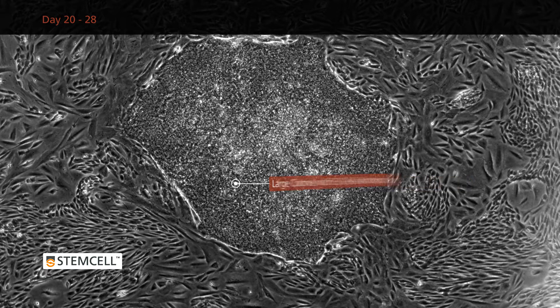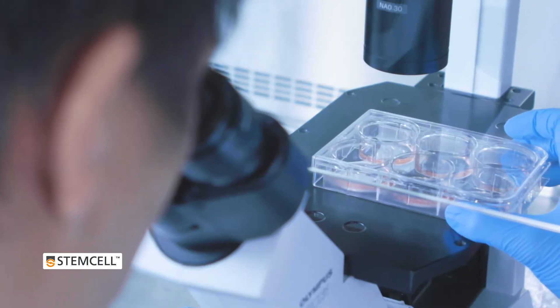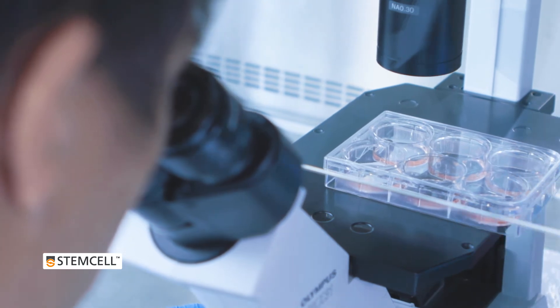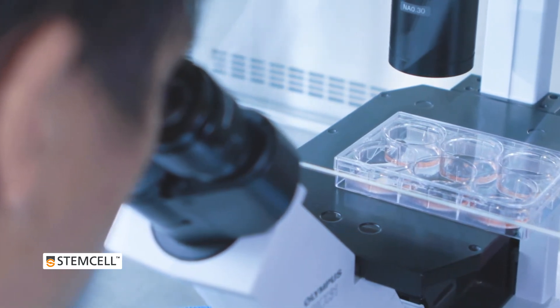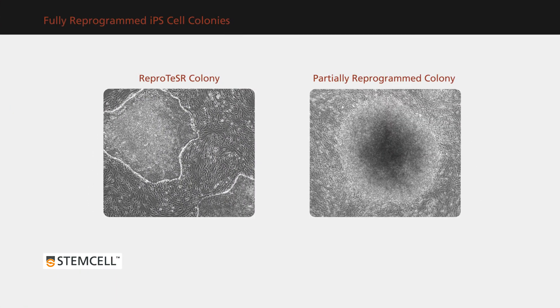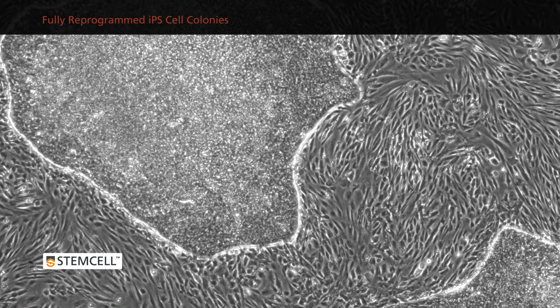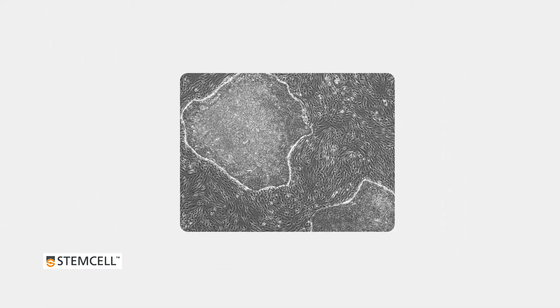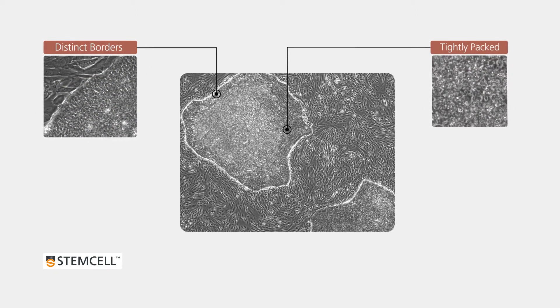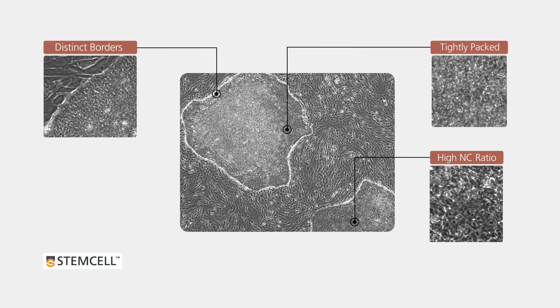In addition to fully reprogrammed IPS cell colonies, differentiated colonies and partially reprogrammed colonies may be present in your cultures. It is important to accurately distinguish between fully and partially reprogrammed IPS cell colonies to ensure successful selection and clonal expansion. Fully reprogrammed IPS cell colonies generated with ReproRNA and ReproTeaser will display the morphological characteristics of embryonic stem cell colonies — they should have distinct borders, cells should be tightly packed with prominent nucleoli, and have a high nuclear to cytoplasmic ratio.